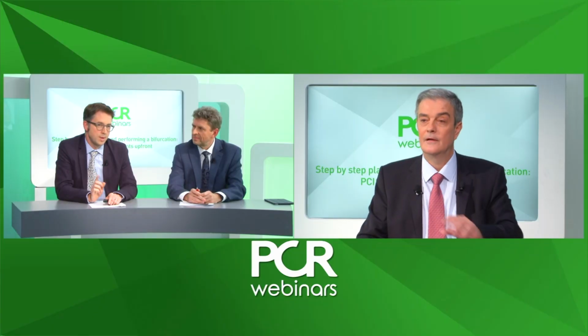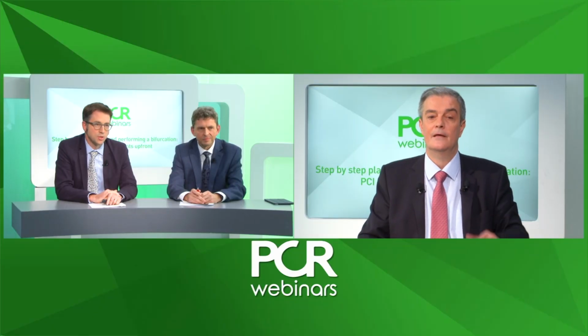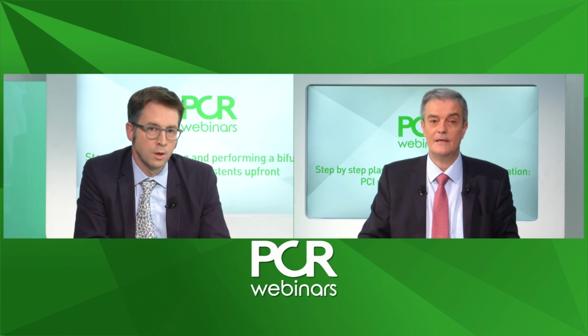Yeah. 2 comments while we are still at this baseline angio on thrombus presence. It looks like there is a large amount of thrombus across the ostium of the circ. And second question, we may have quite a good thrombus burden. Wouldn't it be wiser to do V technique so as to have less balloon inflation in order to avoid the no-reflow phenomenon? So maybe let me show you the next image. Yeah, so maybe we go to the next image.